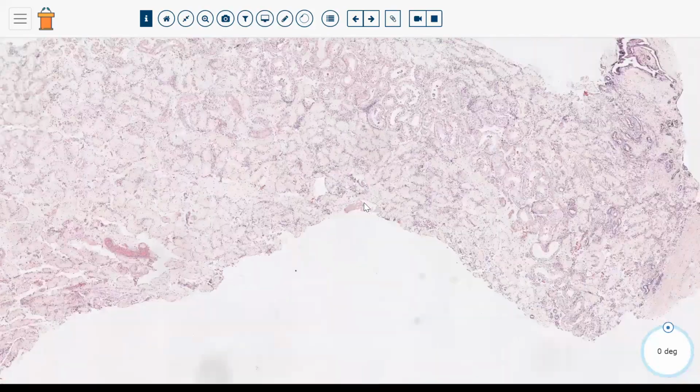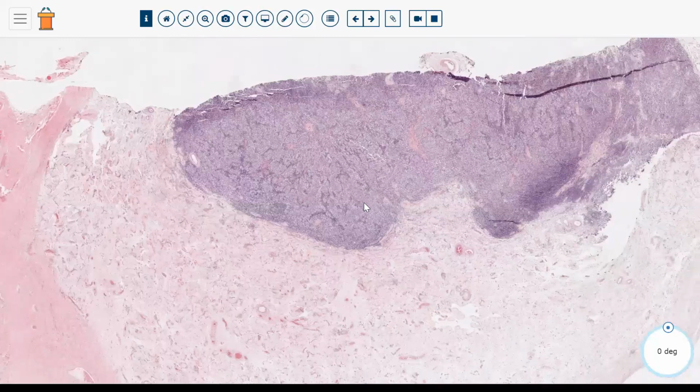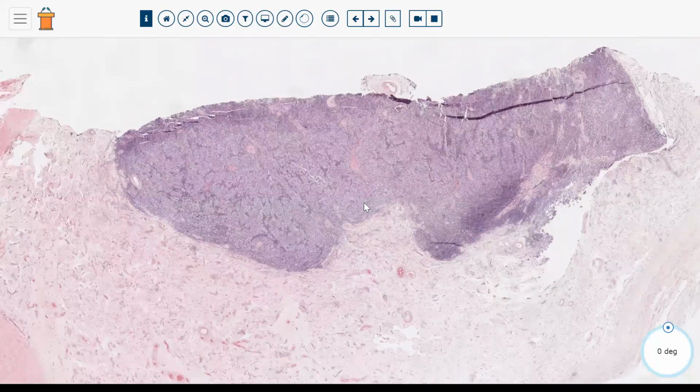Something that I often like to point out about seminomas is that although we think of germ cell tumors as being a tumor of young men, you can actually have seminomas at a fairly late stage in life. So even patients who are 60 or 70 years old can have a pure seminoma. Now, it would be uncommon to have a mixed germ cell tumor or a non-seminomatous germ cell tumor at that age in life, but it is possible. There's a small but significant fraction of men in the age 50, 60, and sometimes even 70 years old who have a classic usual type seminoma.